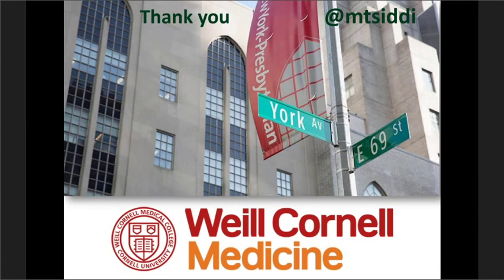Less than that, obviously, people can and do make diagnoses. But again, with well-differentiated tumors and known pitfalls, it's good to have good quantitation. For me, I know it might not be evident in the literature as far as the exact number, but I would say 10 cells or 10 groups of clearly malignant cells, whether well differentiated or more poorly differentiated, should be enough. And additional sampling for a cell block is always good.